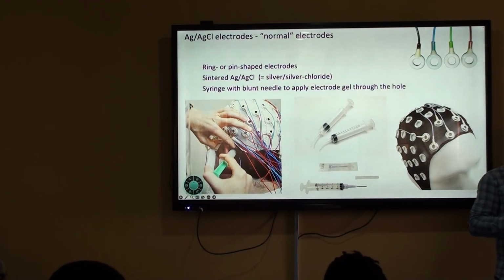Actually, more, I brought in total like 10 EEG caps. It will be interesting to see how those caps fit on the participants here, for example with the hair. The standard procedure would be to measure, then pick the cap and put it on, but I think it would be interesting to see how that actually fits on participants with more hair. Even without applying the gel, that would already be an interesting experiment.